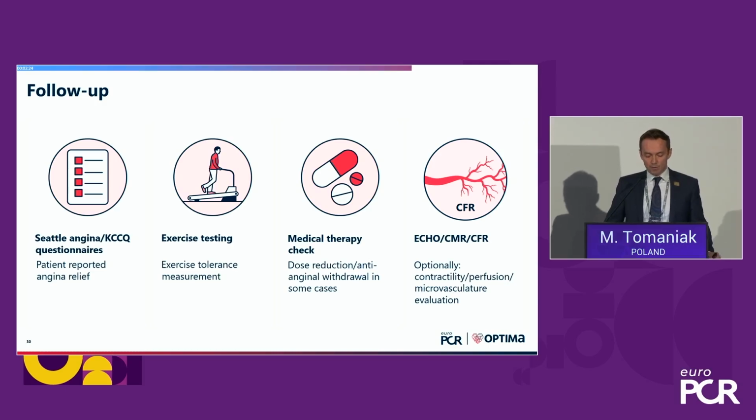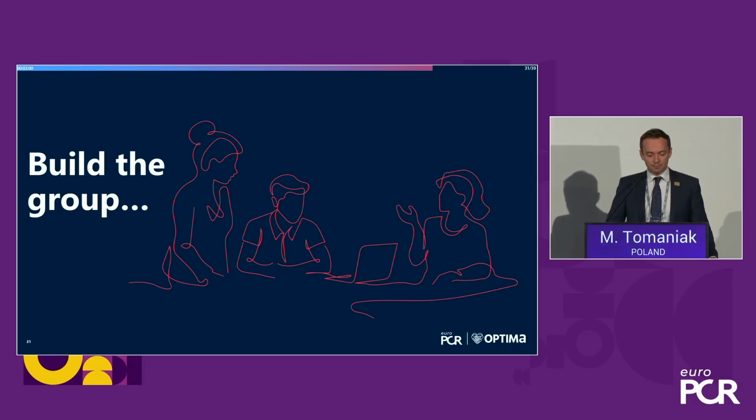We also perform exercise testing at 3 months post-procedure. We do a medical therapy check because some of our patients can have their anti-anginals just withdrawn or reduced. And as an option, but in our center for research purposes we do it routinely as well, we do a follow-up echo, magnetic resonance imaging, and invasive microvascular assessment.